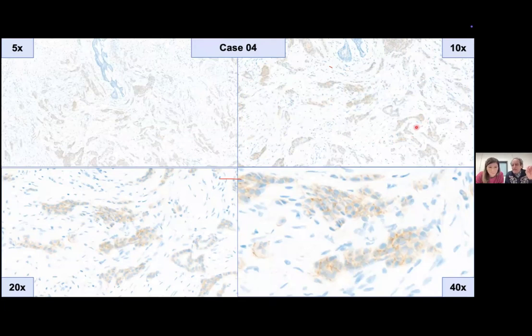So when I say, do you see membrane staining at times 10, I don't mean strain yourself. I mean comfortably, something that nobody will object to. I think I can say it at times 20. So we are already in the weak range. And now the question is, is it circumferential? You can put a higher power still.